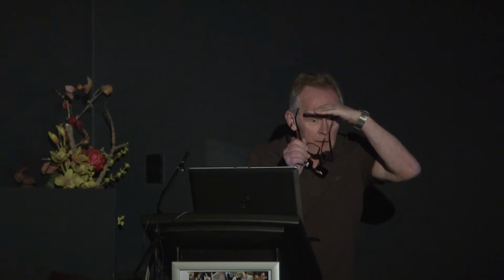Can I just ask if anybody has cone beam imaging, uses it on a regular basis? Okay, one person. That's the lady from South Australia. Yeah. Okay. I think there's one in Hobart. Okay.